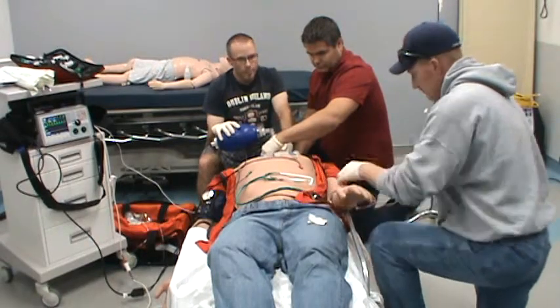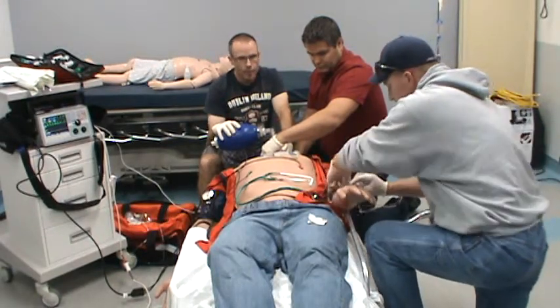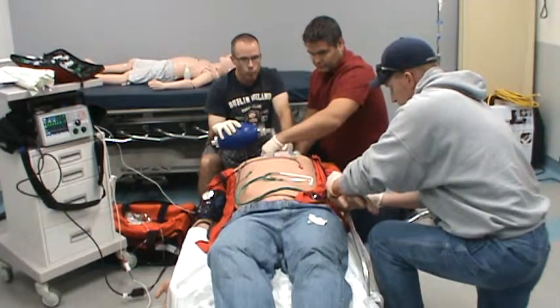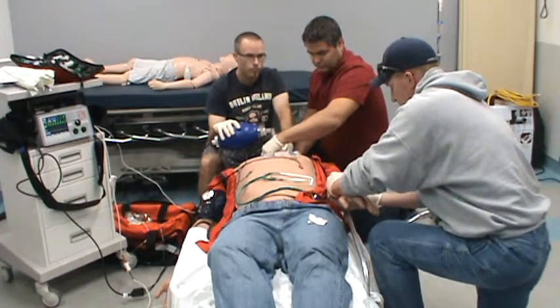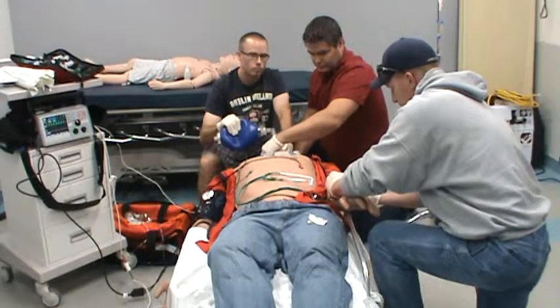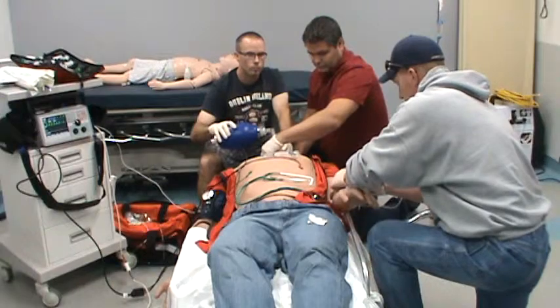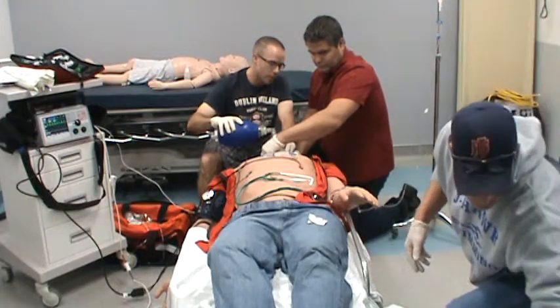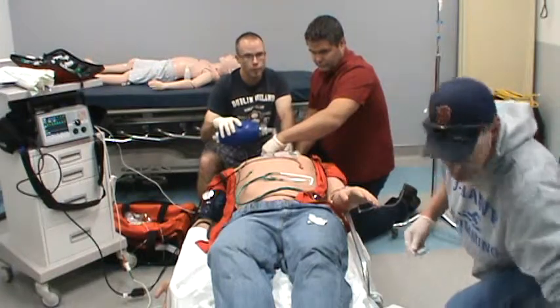Once that's given, we're going to be looking for the fasciculations. As soon as the fasciculations stop, I will go ahead and intubate. Okay, sux is in. That's at 1352.